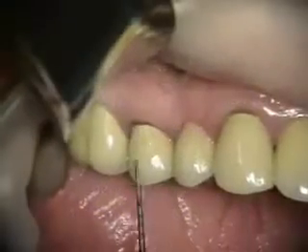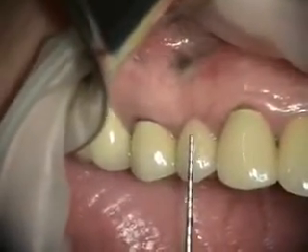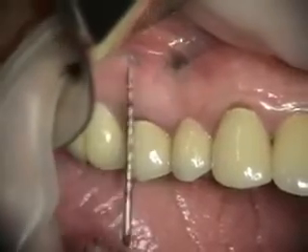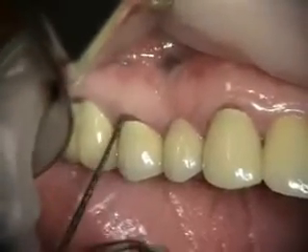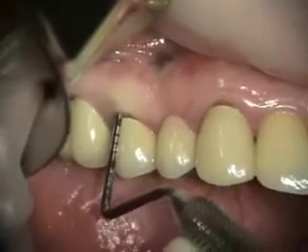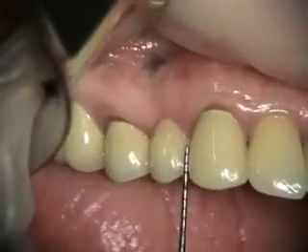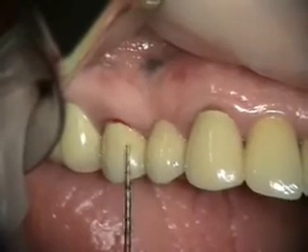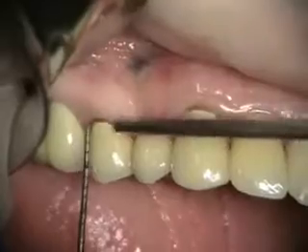Three-unit bridge here from the cuspid to the premolar. You can see that this premolar is a pontic but previously had some endosurgery. Number four is failing — it's fractured. So we're going to be removing this, cutting this, placing an implant here and doing a provisional, then removing this tooth and placing some bone graft.